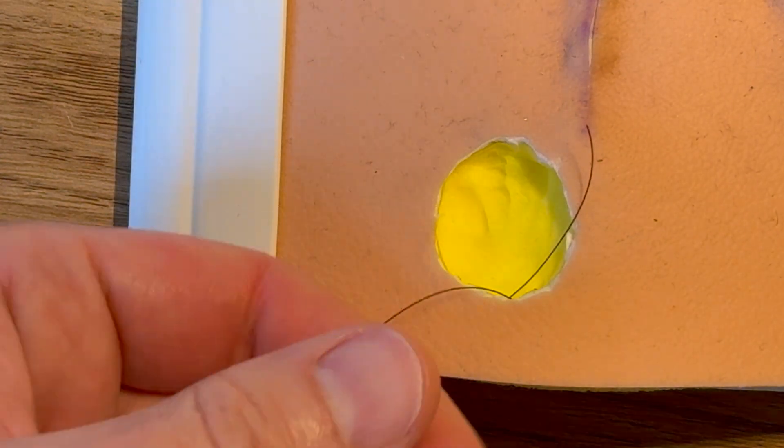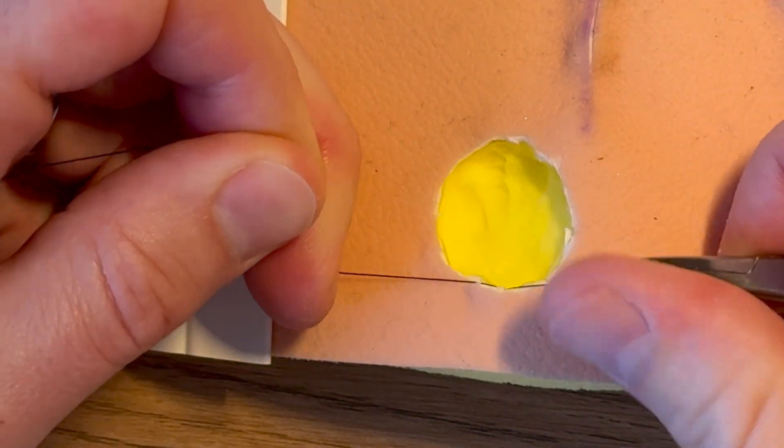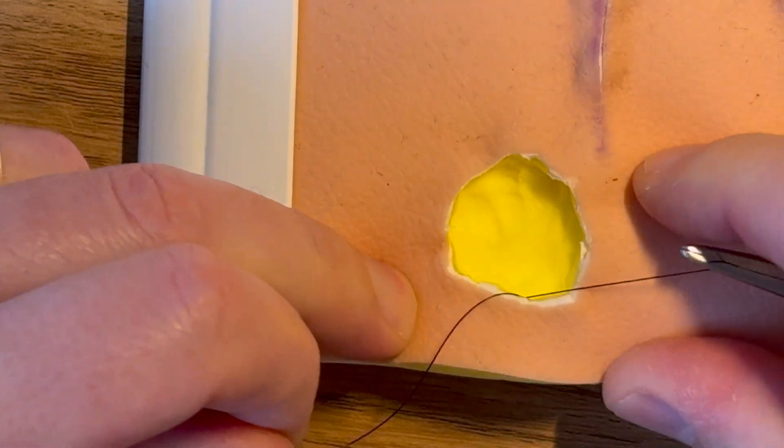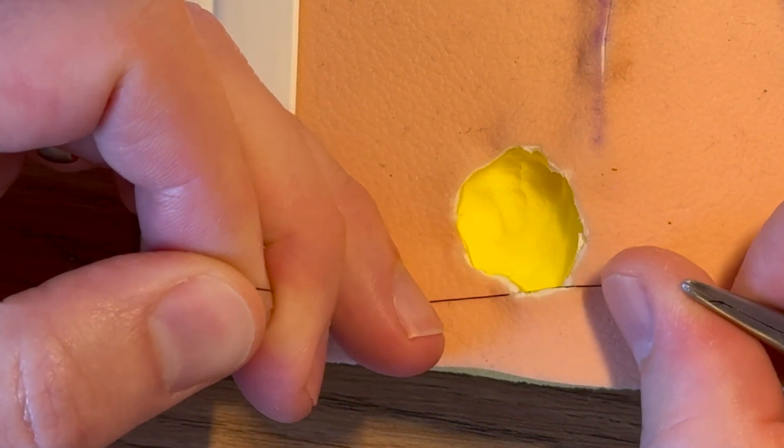Then make sure they're not actually overlapping, and then it should be just a question of grabbing both ends and pulling them a little bit. So as we pull them we should see the edges draw in. We can see here it's just over two centimeters hole and then as we draw it together.